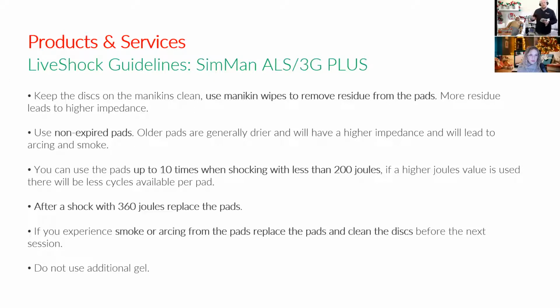So those people using Zoll products, they go to 200 joules, but LiveShock, I know for this one here, I can go up to 360 joules. And if you do go up to 360 joules, these pads can only be used once. That's a lot of energy through this little pad. So that's another big note to keep in mind. Yeah, and that's actually the point right after. So again, after a shock of 360 joules, please do replace the pads.